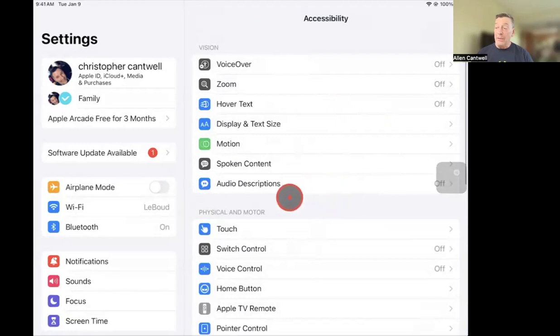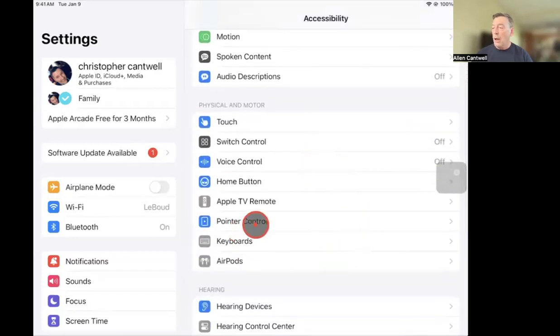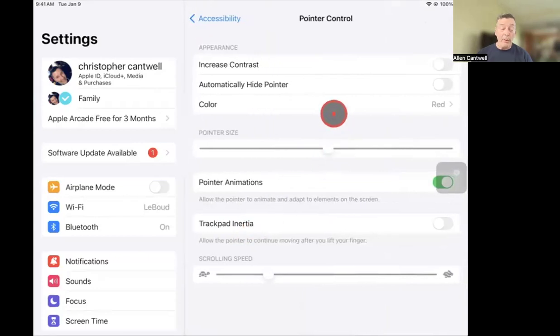This pointer that you see on the screen might be something else you haven't seen before on your iPad or your iPhone. When your Cato is paired with Bluetooth, it's going to show up. And one of the things that I wanted to be sure to focus on today was pointer control and what kind of configuration you have over that. So the pointer size can be shrunk down to smaller. Actually, I think you'll see it go smaller than it's displaying here. It can go very large.